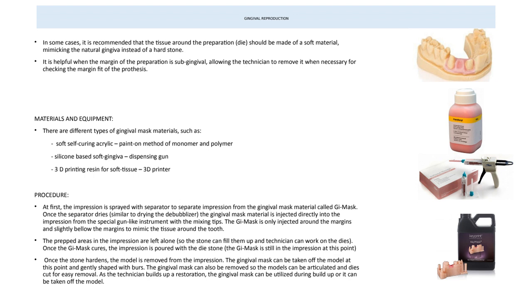And again, when we start printing, if we use a printing system, we have to use the resin that comes with that system for better accuracy.